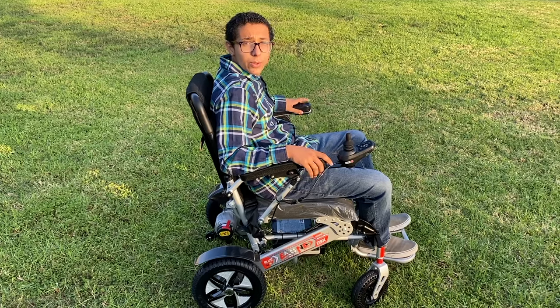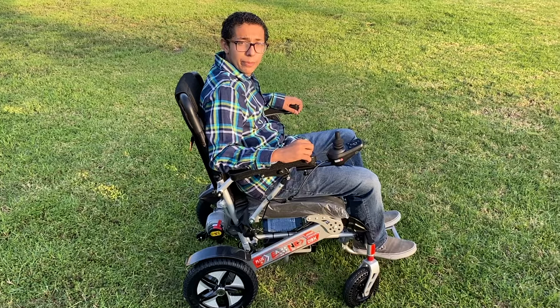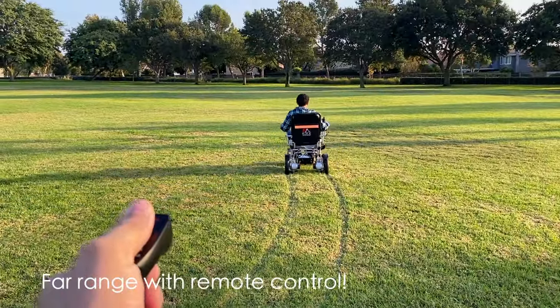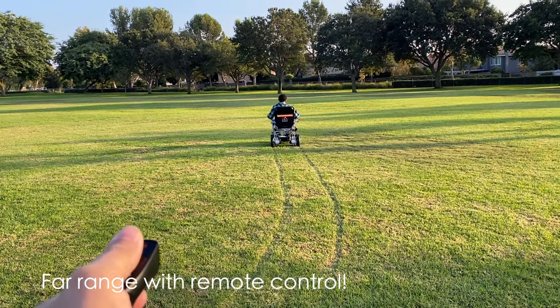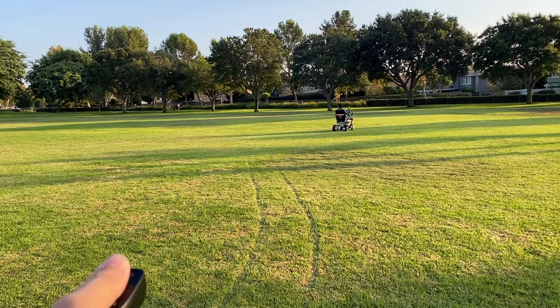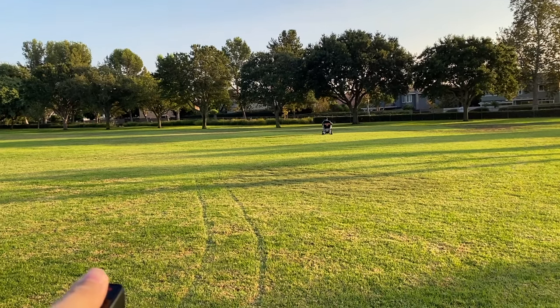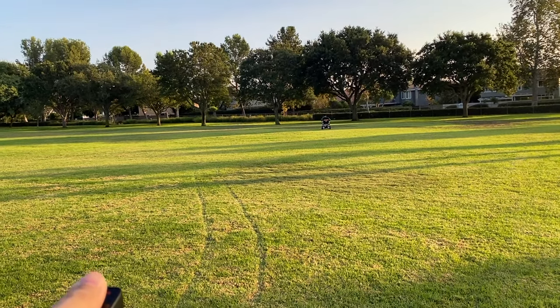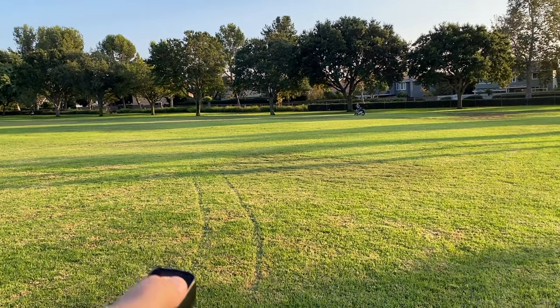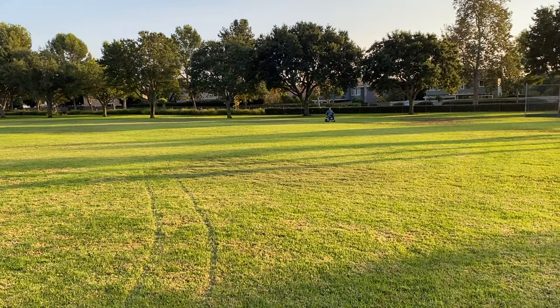Anyone who tells you the wheelchair is automatic, tell them to move it with their remote control and take a look at the vehicle.